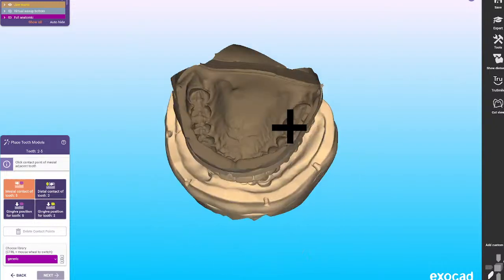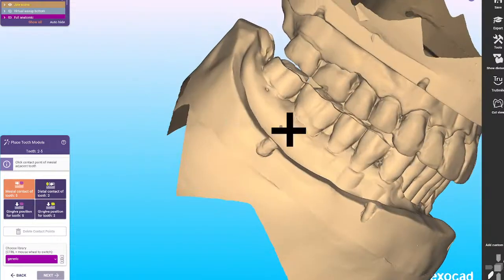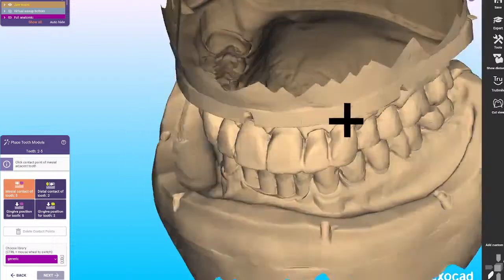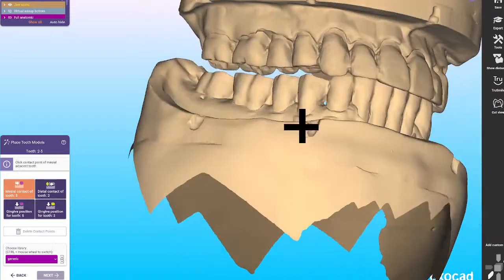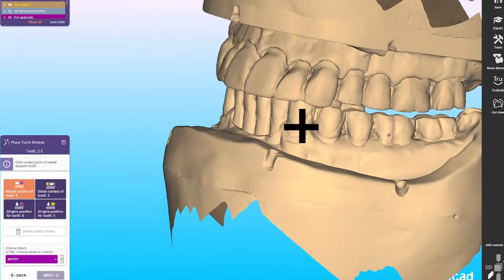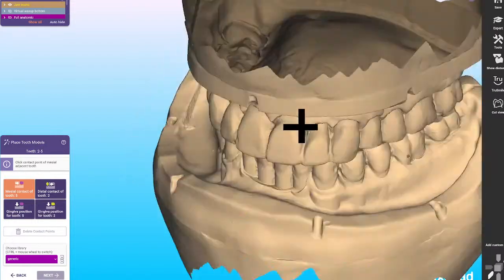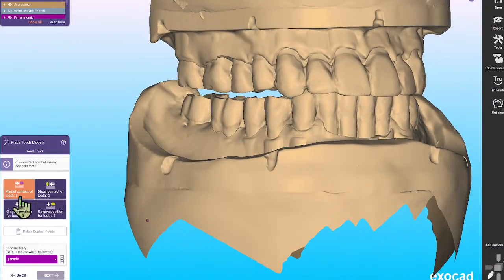Okay, so there we got our cast, and you could see the type of wear that the patient has. Well, in this case, in the posterior. So that's what we're going to do. We're going to wax both the left and right posterior, maxillary and mandibular, and then we're going to check the occlusion, and from there we're going to print the wax-up, and then we're going to make a putty, so we could do our overlay try-in.